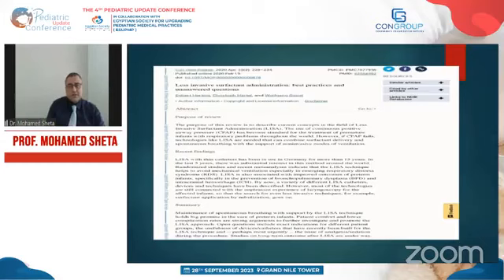These are some studies done on the LISA procedure in many countries. I got many of them just for you, if somebody wants to check and take a look at all of these studies. These studies prove that the LISA technique is very effective and decreases the risk of BPD and IVH in newborn infants, especially premature.